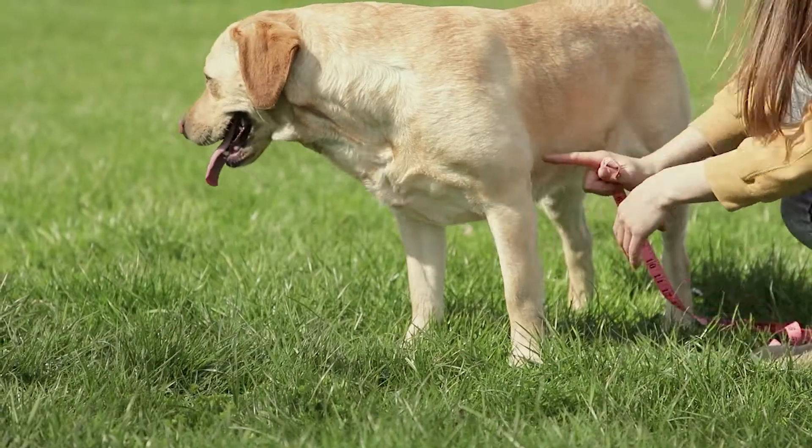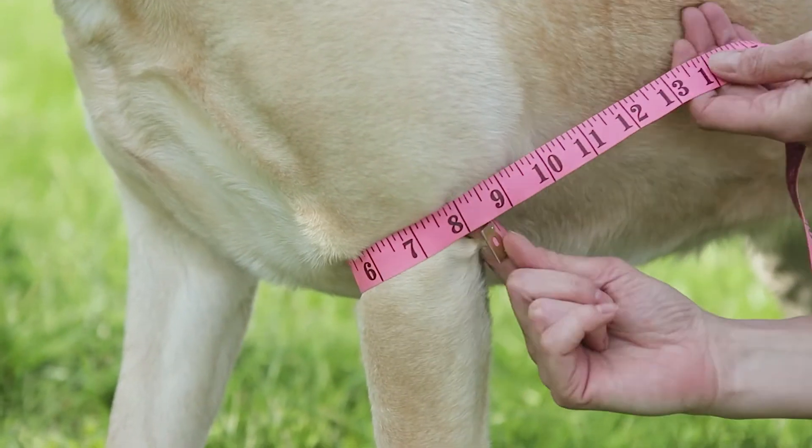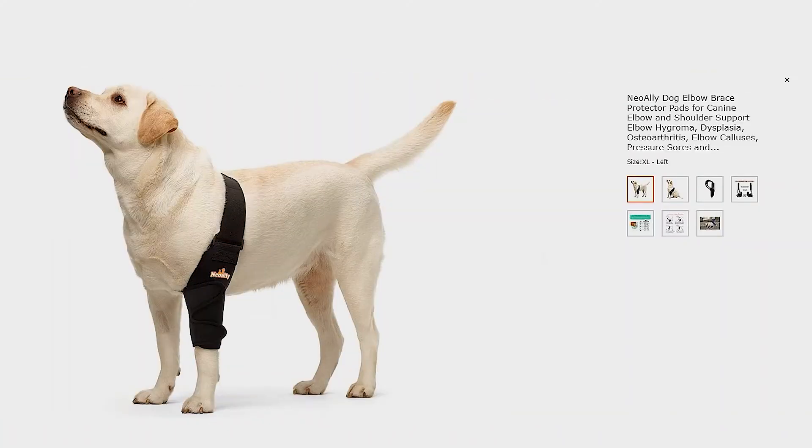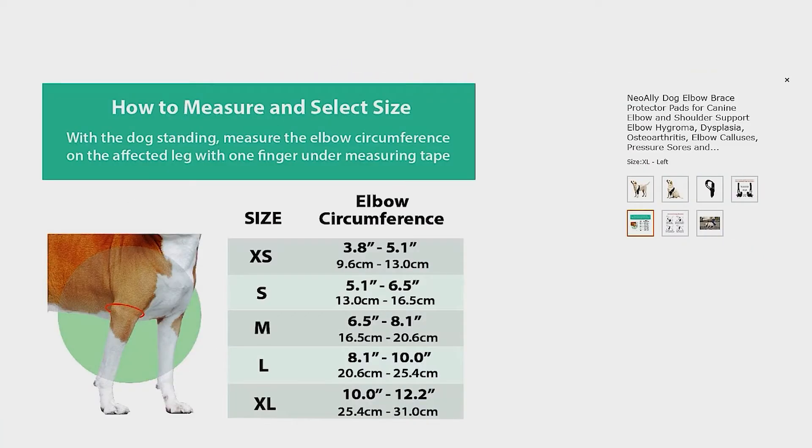Locate your dog's elbow on the affected leg. Measure the leg circumference with one finger under the measuring tape. Scroll the image carousel to the size chart and choose the correct size.